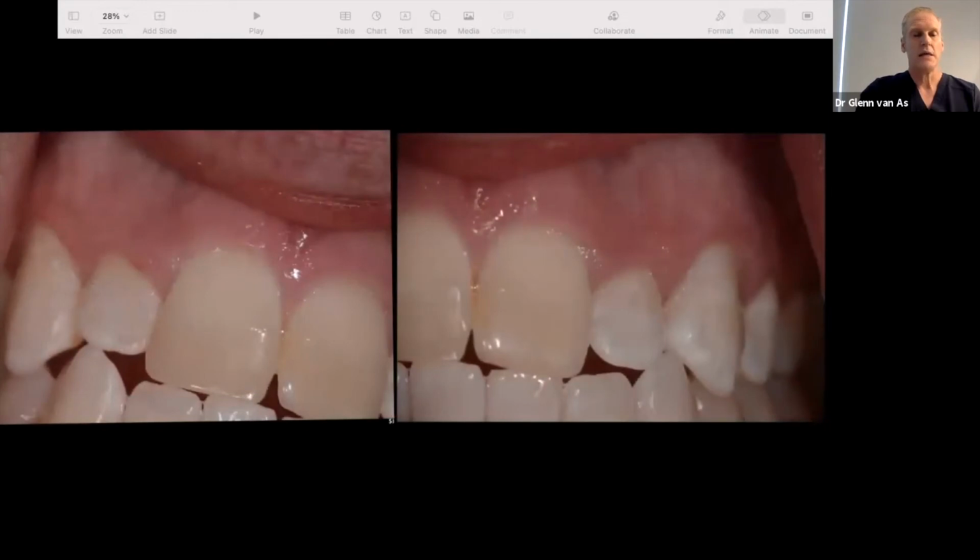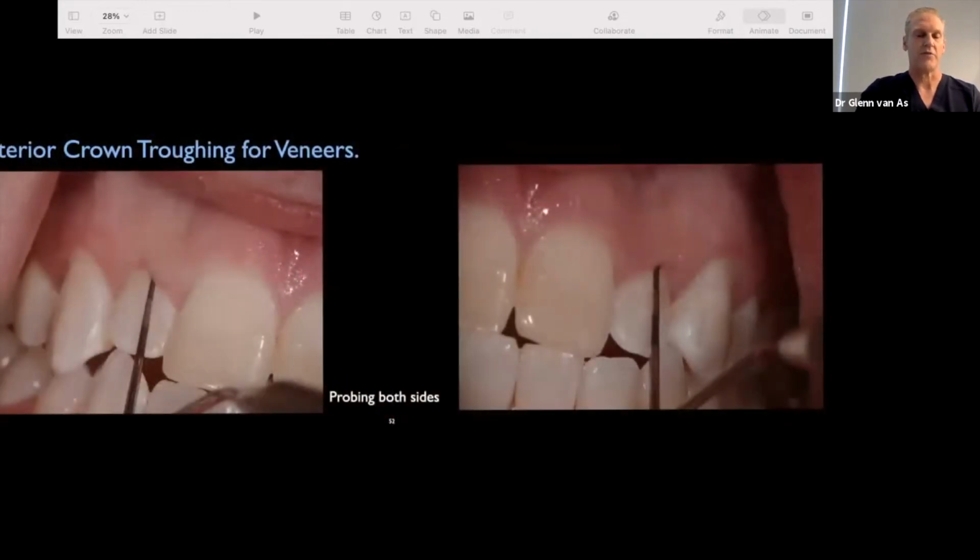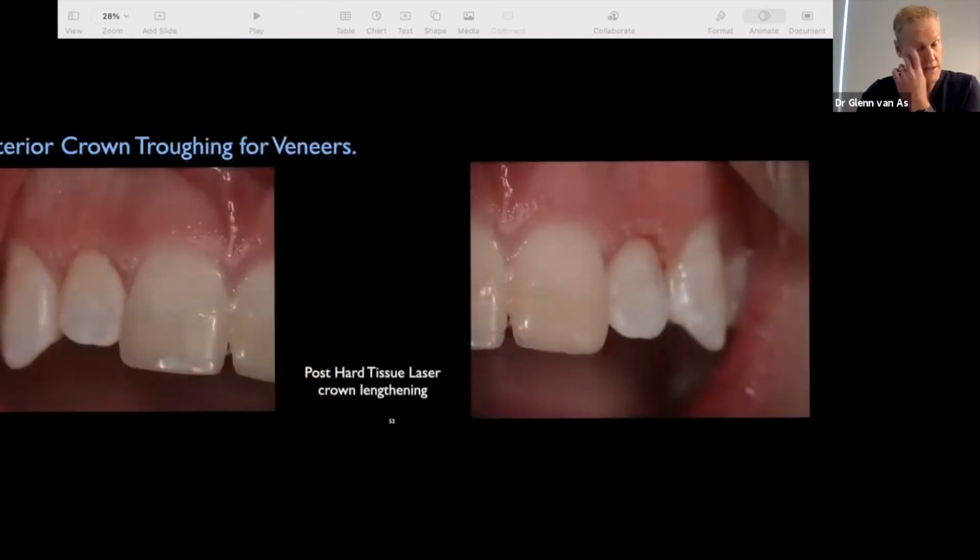and I'll show you that in a little bit about how you do that. But here is the pre-op photographs, and what we did again was we sounded to bone, and we removed some soft tissue on the day of the preps. So I'm that comfortable with the case that I removed and recontoured, and the smile recontouring in this case, as you see here, on the day of the preps before I prepped the case. So we did not only soft tissue recontouring, but sounded to bone and relieved about 1 millimeter of bone underneath.